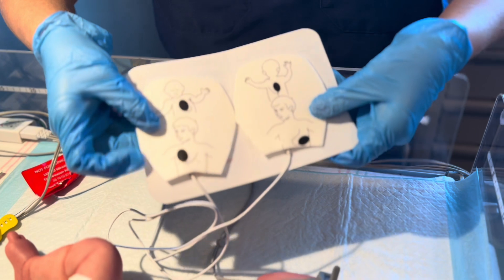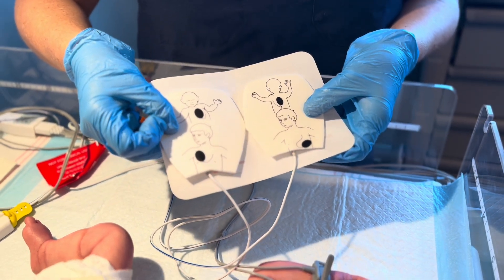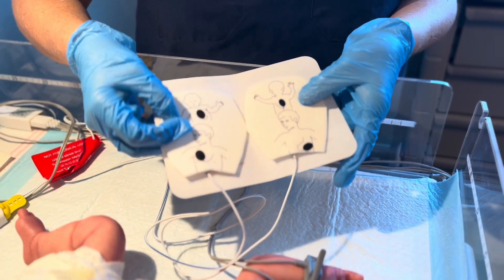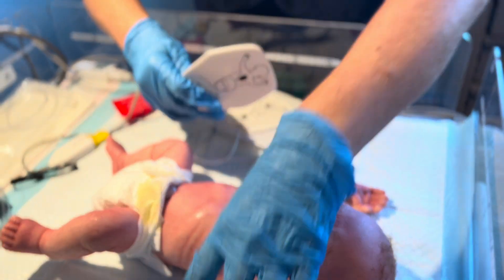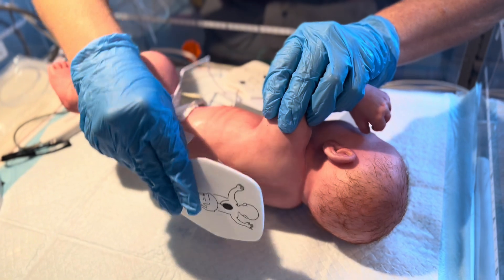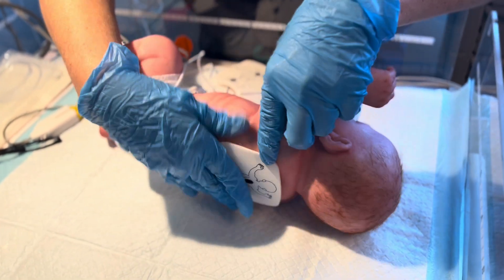Now, on to the pads. As seen in the picture, you need to apply them on the front and the back of the patient, or anterior posterior placement. Start with the posterior placement by rolling the patient over on their side and placing firmly on the back.